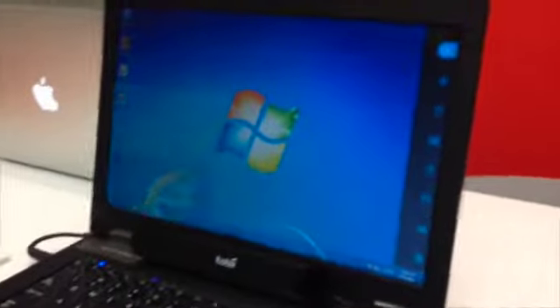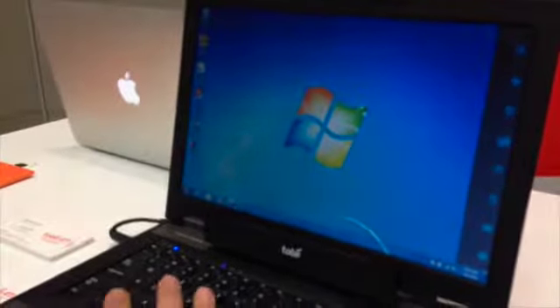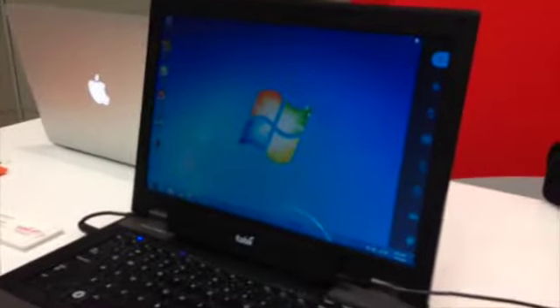So for example, if I wanted to open Internet Explorer, we typically would take our cursor, go over to Internet Explorer, and do a single click. Right, but not everybody has that capability. So I'm thinking Stephen Hawking here. He would be someone who would quite potentially.